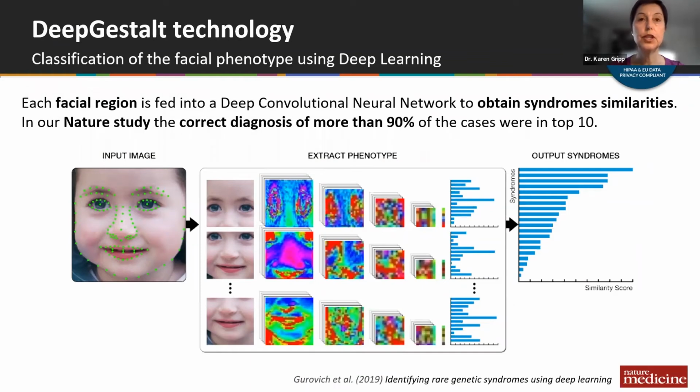And in Face2Gene, you know you can take an image, a photograph of the patient in clinic. The algorithm then recognizes the photo as a face, places a number of landmarks over the face as shown here, and then analyzes predefined regions individually and in a series of steps as a composite. And this abstracted data from the facial photograph is then compared and matched to a number of rare syndromic conditions that the system has previously been trained on.